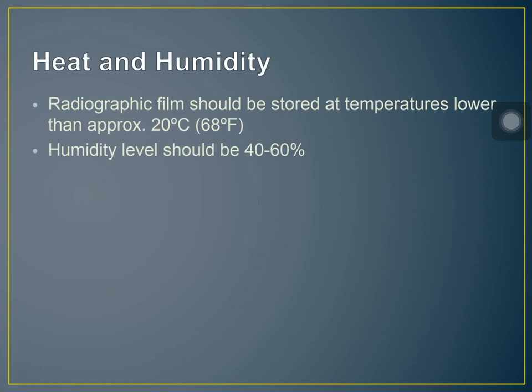So, kapag nagkaroon kasi ng pressure yung ating film, pag pinlace natin siya pahiga, pa horizontal instead of vertical, this pressure can cause static artifacts on the radiograph or on the film itself. So, pwede din na kapag ang handling sa film is rough, yung bigla ang pagbunot, biglaan ang pagpasok sa isang kaset, magkakaroon din siya ng static artifact.